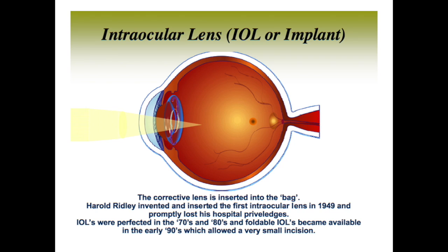And in the 90s, we started using the foldable implants for the first time, and that's when, at the same time, surgeons started adapting the phaco emulsification technique. Prior to that, the phaco emulsification technique only required that small incision, but the incision needed to be enlarged to put in the hard plastic implant.